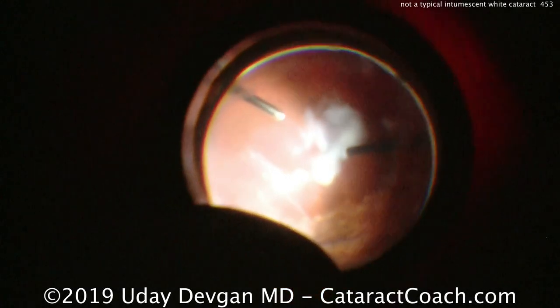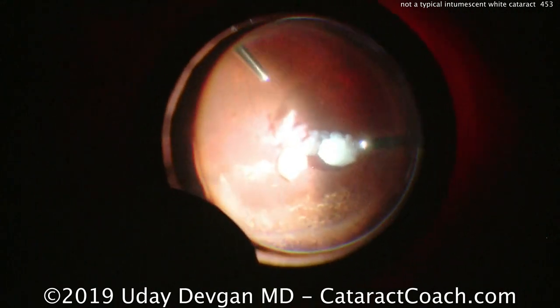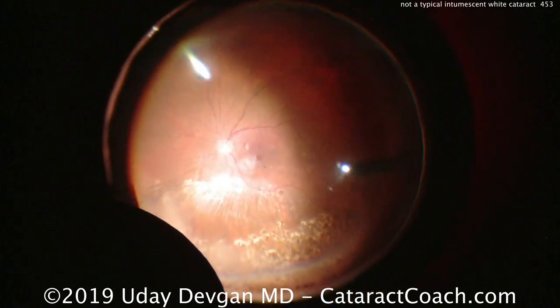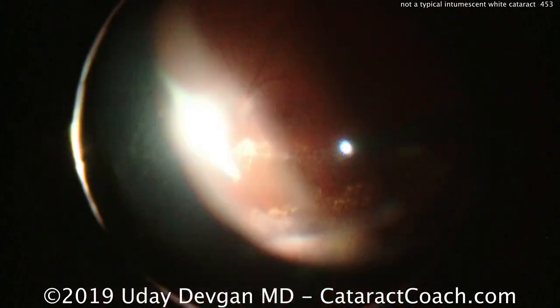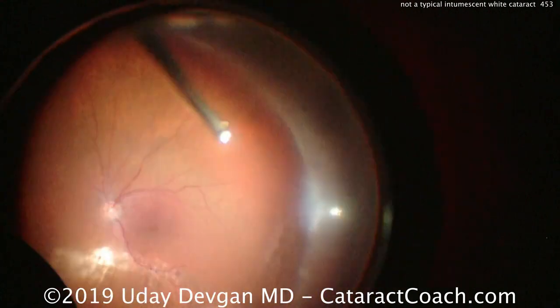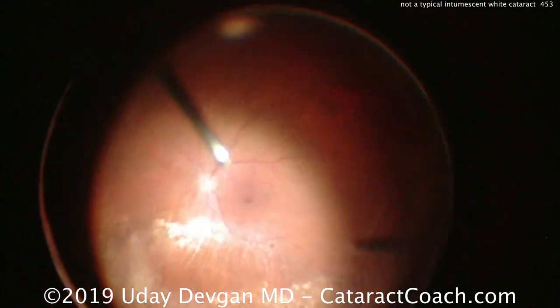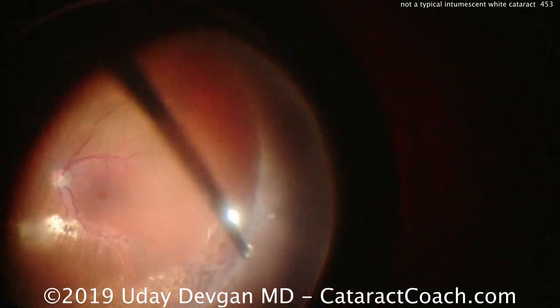Entering with the MVR blade — let's take a look. There's our lens material floating right there on the retina, and very carefully he's going to remove all that lens material. I don't do pars plana vitrectomy surgeries like this — I think we're much better off sending it to our vitreoretinal colleagues who have a high degree of expertise. In my area of Los Angeles, it's far more common for cataract specialists like me to stick with cataracts and anterior segment surgery and work as a team with a dedicated retina person.